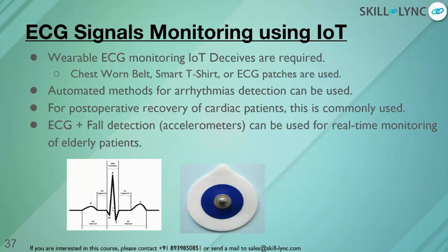So that can also happen. So we have to think about the aesthetic, we have to think about the social implications of the person, and we have to monitor this. So if you could see here, these kind of sensors will be placed near to the body. They are generally called electrodes.